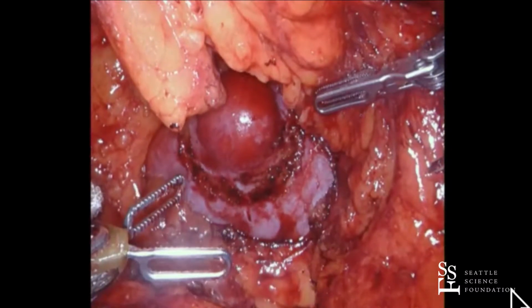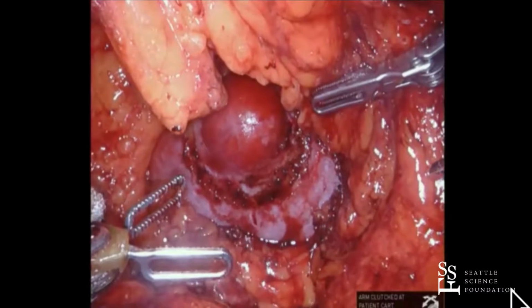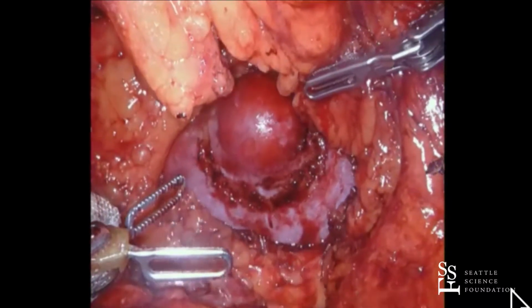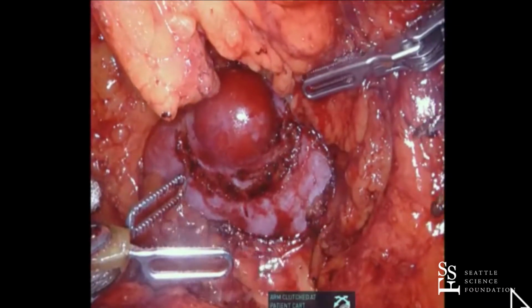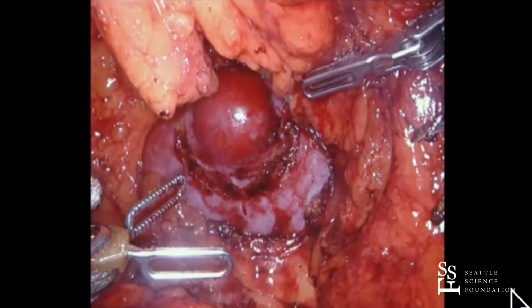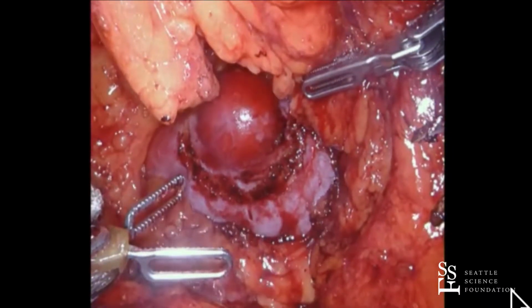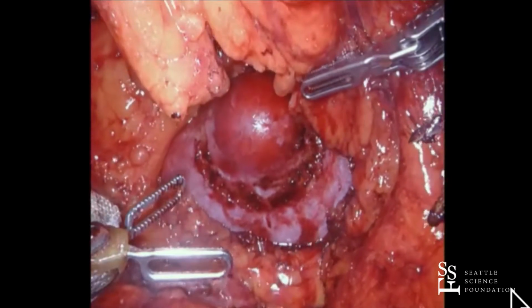Honestly, it doesn't bother me, because I don't mind seeing a little bit of arterial bleeding. If it's not completely compressed, that actually helps me find the arteries and then I go bipolar them. But if you really want a bloodless field, you may want to have your bulldogs checked periodically and get newer ones if they're getting loose. Or you could put two on. Is that what you do? You put two on the artery? Which bulldog is he using?